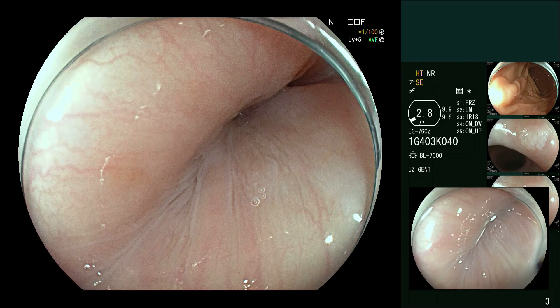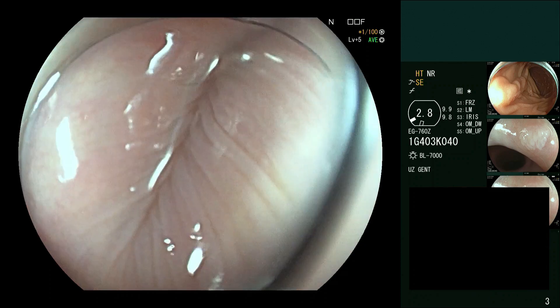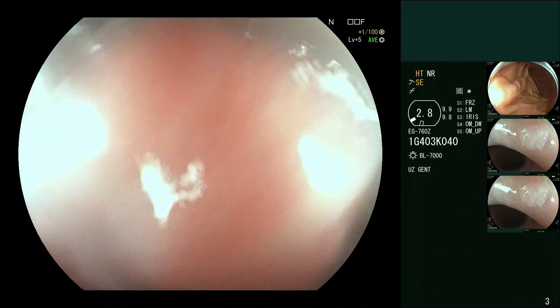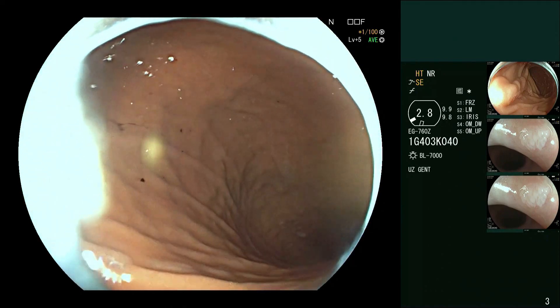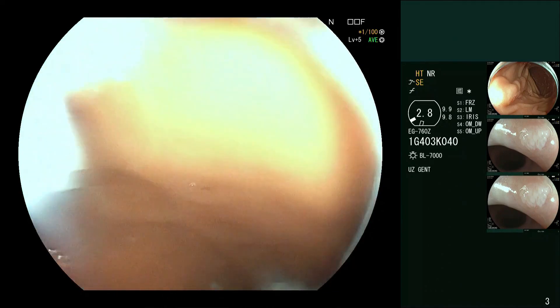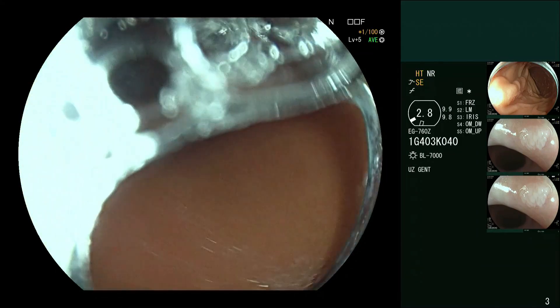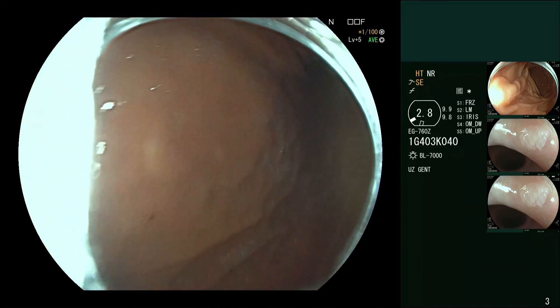Welcome. Here we are doing a gastroscopy with a Fuji EG-760Z endoscope. I want to highlight a few things about gastroscopy for high quality everyday endoscopy. This patient is under propofol sedation, not intubated, and we are coming into the stomach.